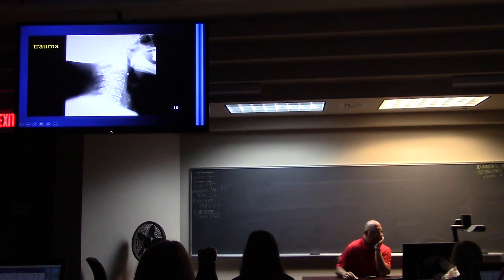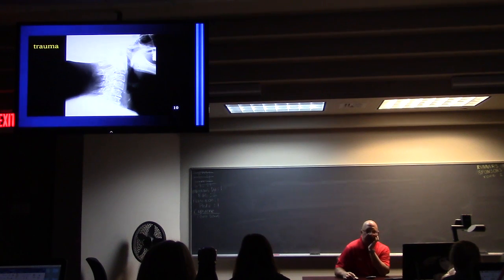The soft tissue at 2 should be less than 5 or less than a vertebral disc space. That looks good. 2, 3, 4, 5. Soft tissue at 5 should be less than 22 or less than the vertebral body. It's getting close. What do you think? Take it off? I don't think so. We don't really see 7 there.